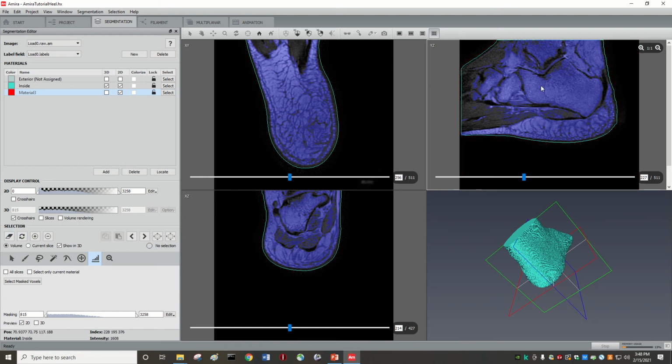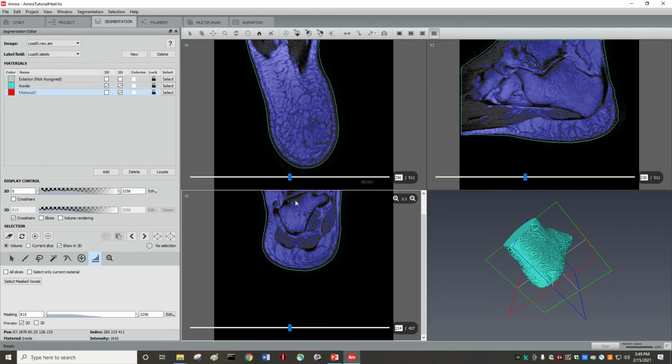And so we need to select a plane to cut. So I would say that, for example, this plane over here can be something nice because the calcaneus makes this curve, so we can remove this curve, so to simplify everything. And also like this part over, like the above, we can cut it also over here. So we need to go in the plane of the first cut, that will be this vertical one.